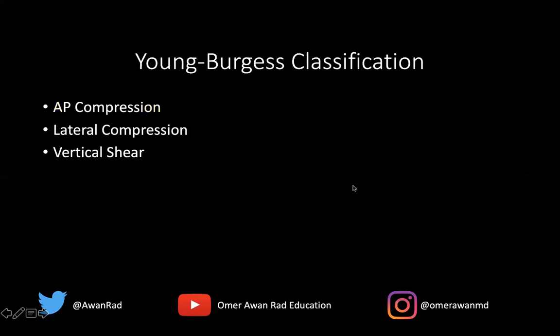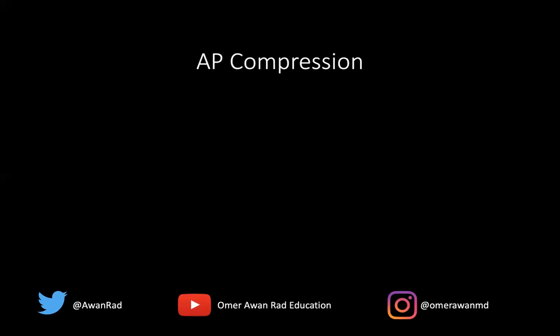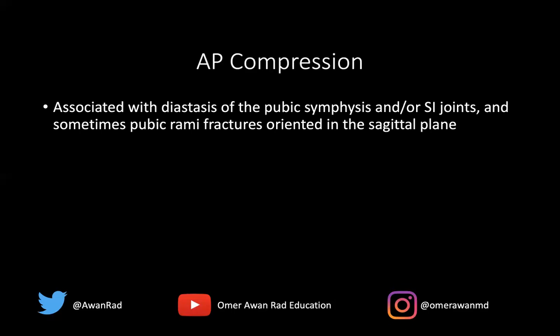And I want to talk about the Young Burgess classification of pelvic fractures and pelvic injury, because I think it's really important. This is how we classically classify pelvic fractures. There are 3 types: AP compression, lateral compression, and vertical shear injury. These are the 3 main types of pelvic injuries based on the mechanism and the direction of the force that's applied to the pelvis at the time of the injury. As we saw in this case, AP compression is typically associated with diastasis of the pubic symphysis and/or SI joints. And sometimes there are pubic rami fractures associated with this.